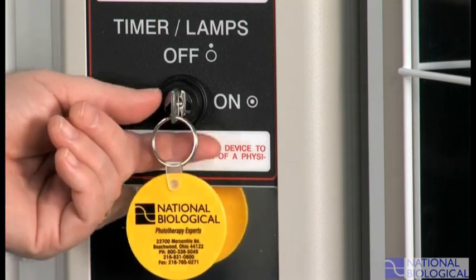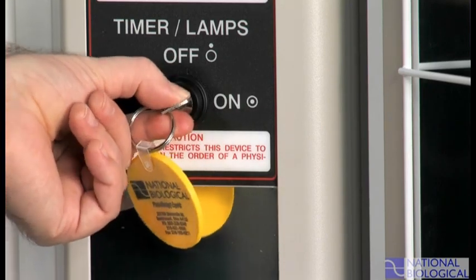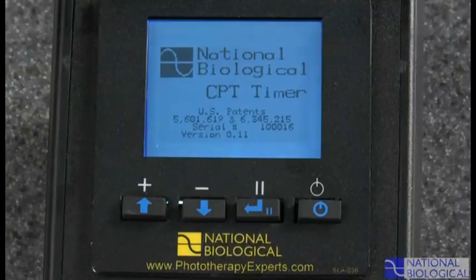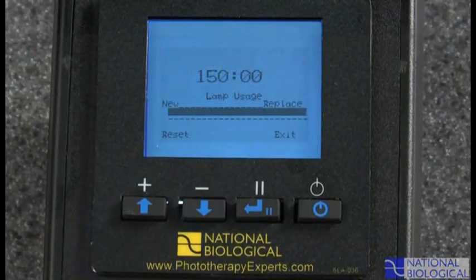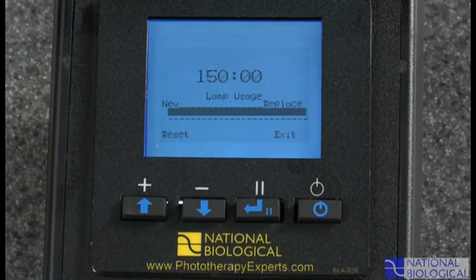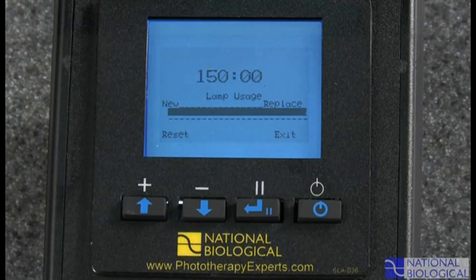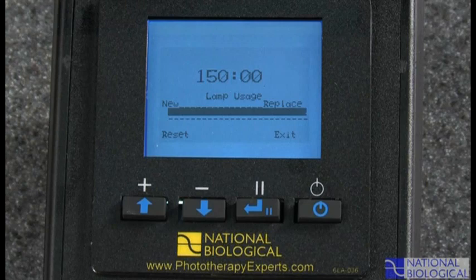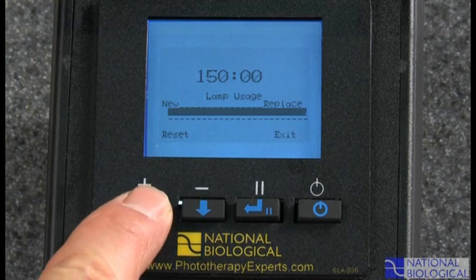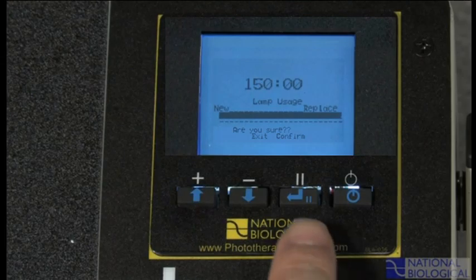To check your lamp usage, turn the key switch on. As soon as the intro screen appears, press and hold both the up and down buttons at the same time. The lamp usage screen indicates lamp hours that have been used, and the progress bar shows when it is time to replace them. You can reset the lamp usage gauge after lamps have been replaced — go to the lamp usage screen and press up, then press pause.